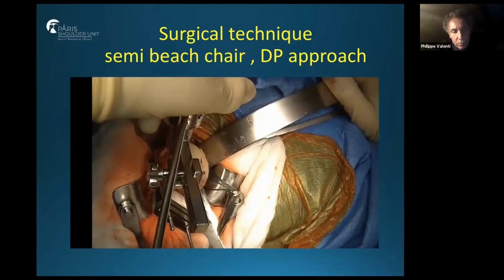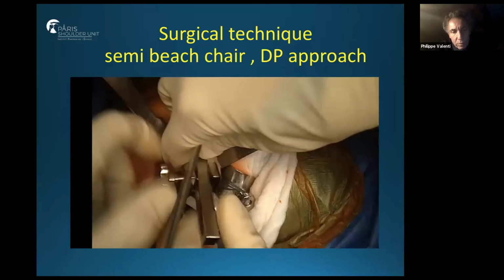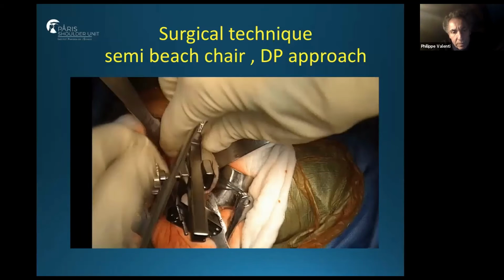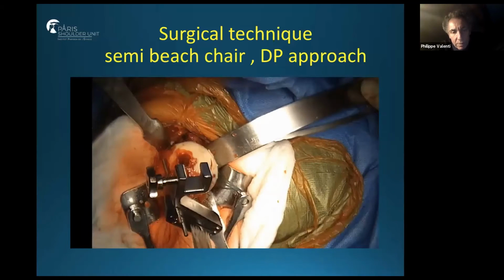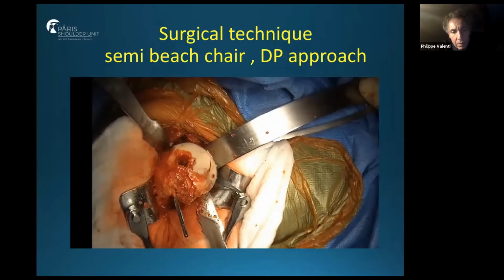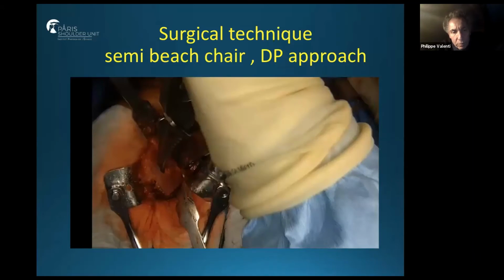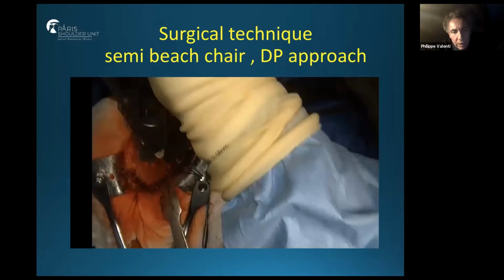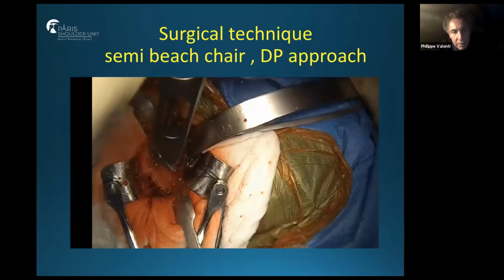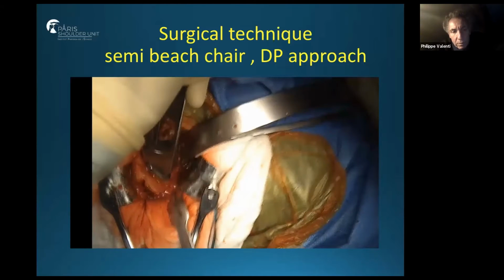We have two positionings, for anatomic and for reverse. And we cut a little more bone on reverse because this is an onlay system. Okay. After, you put your stem, and we protect the superior part of the humerus.